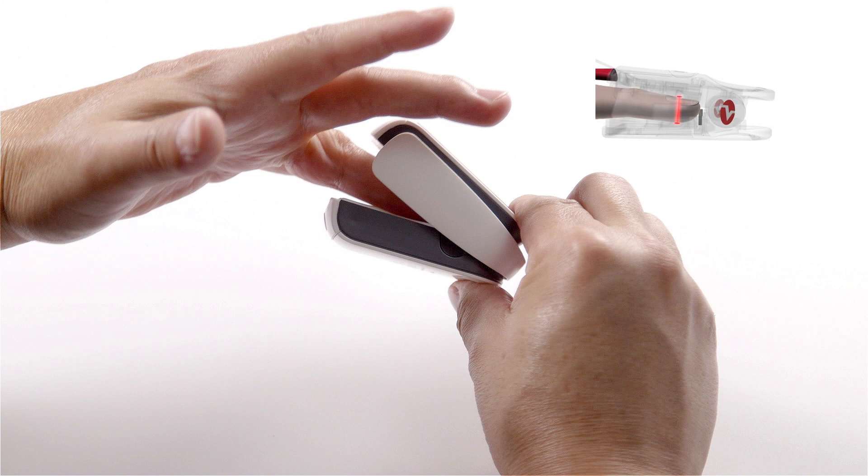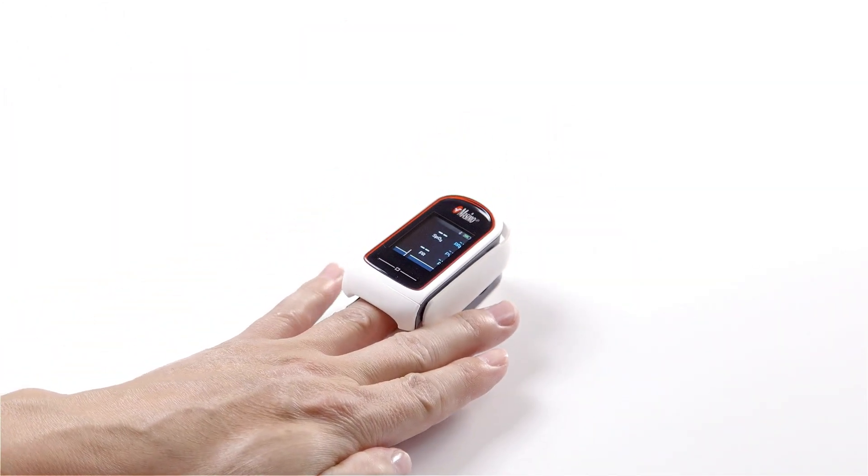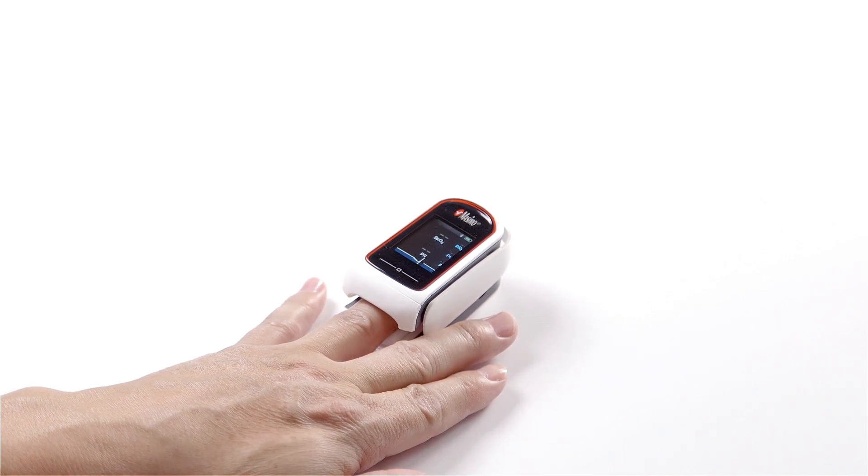Ensure the finger is correctly positioned for accurate measurements. Once the finger is correctly positioned, gently close the MidiSat RX by releasing the pressure on the back of the device. After a few seconds, MidiSat RX will display readings.